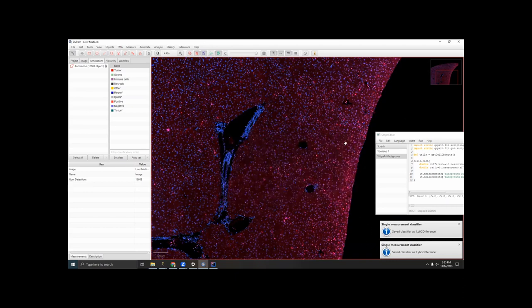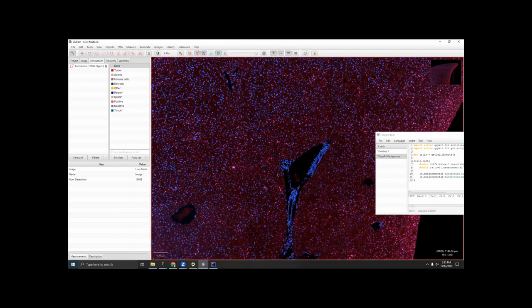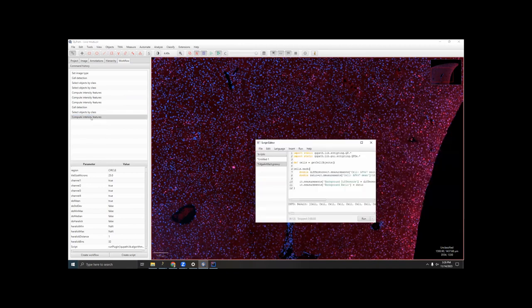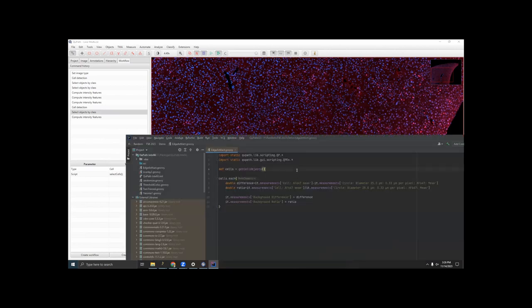Okay, now we've saved that. So overall, this script does exactly what we need, but we can actually make it a lot more functional in a couple of ways. First, we might as well include computing the intensity features right in the script. That way we don't ever forget to do that accidentally. So I'm going to go to the workflow tab and find the line where I selected all of the cells, right click, copy, go back to my script editor and put that at the top.